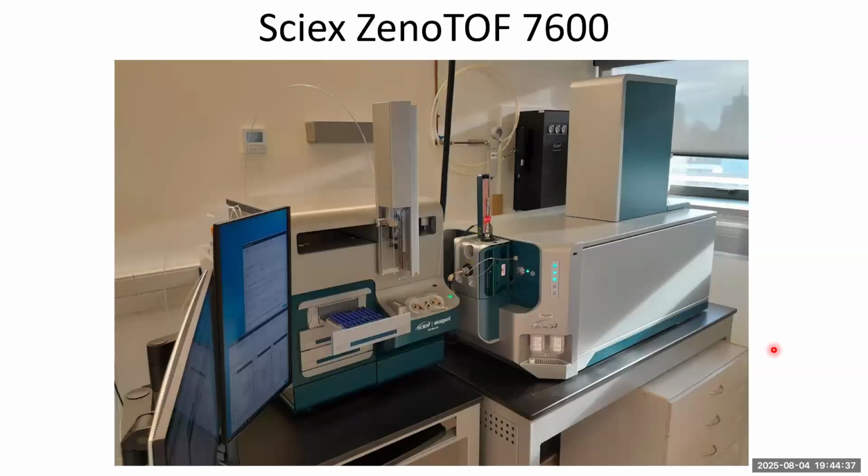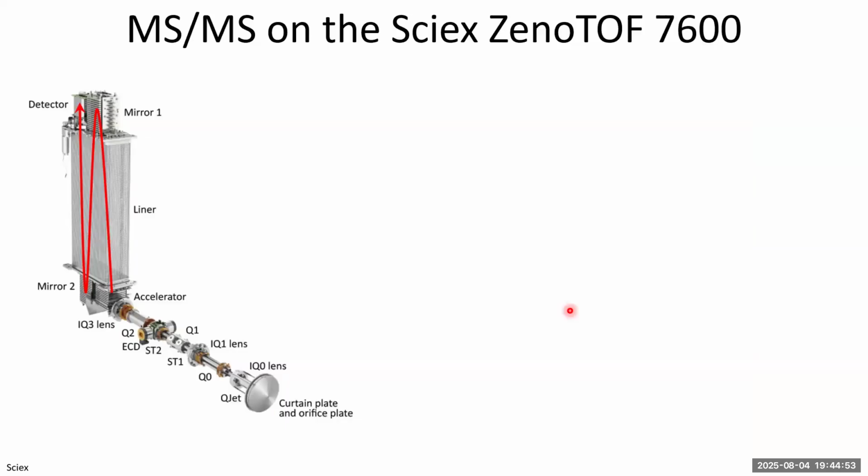So this is the wider view now. We've got our autosampler tray open where the vials are. Here's our ion source with the column, and now this is the actual mass spec part where we've got our ion path and the flight tube inside this housing. So that's the actual setup from further away.